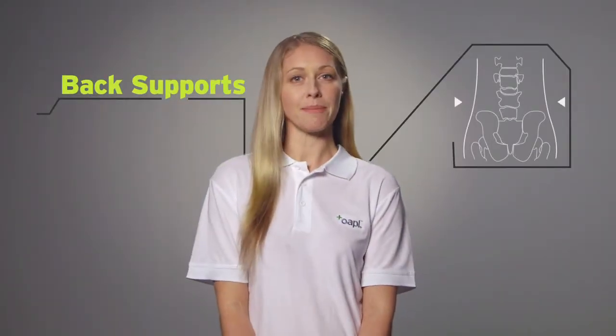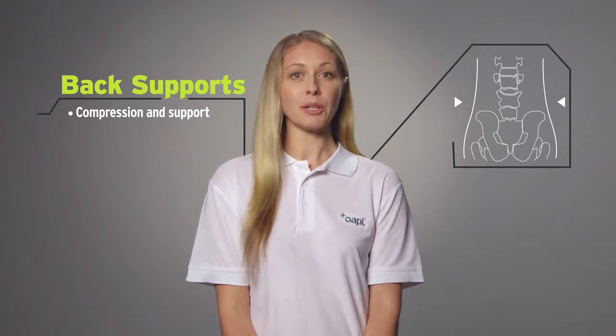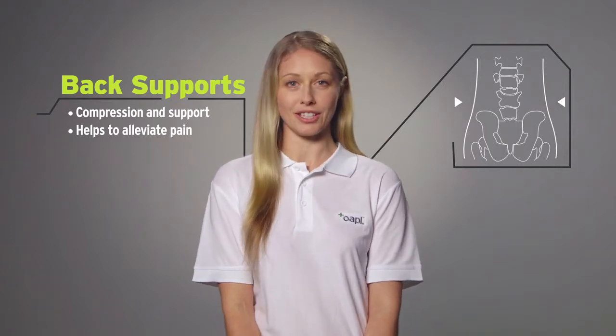oapl offers a range of abdominal and back supports which provide compression and support. They can be used to help alleviate chest, abdominal, and lower back pain caused by a variety of conditions.